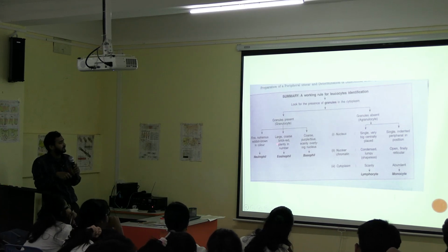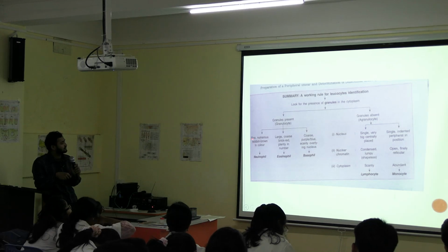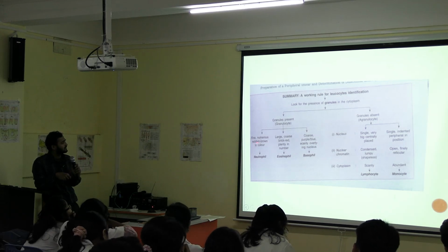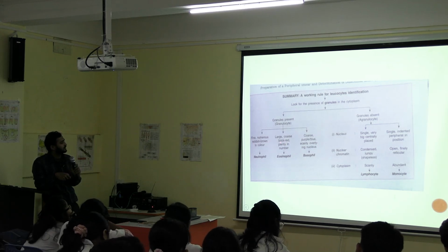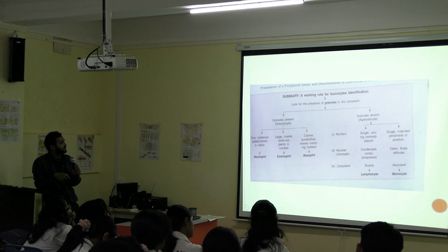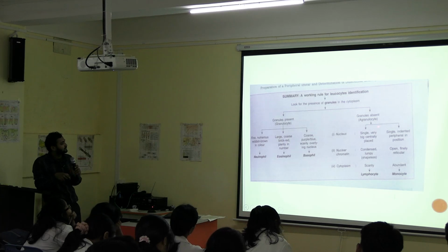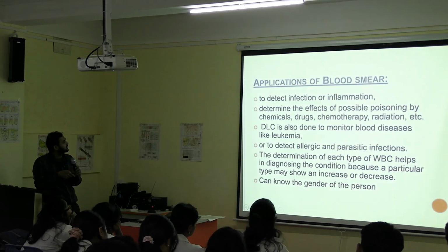And in the other, the granules will be coarse, okay? Then you have to differentiate within the colors also. Suppose here it is brown, reddish brown in neutrophil, and in eosinophil it will be red, brick red, and in case of basophil it will be purple or blue, scanty, okay. And these are the granulocytes.